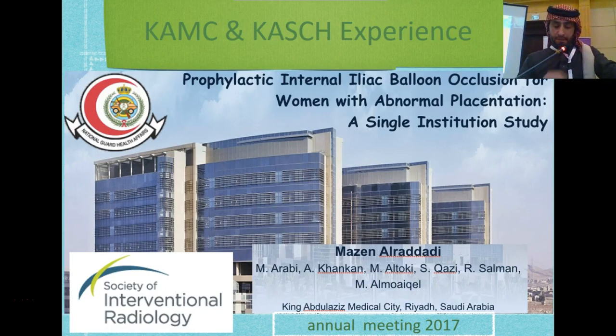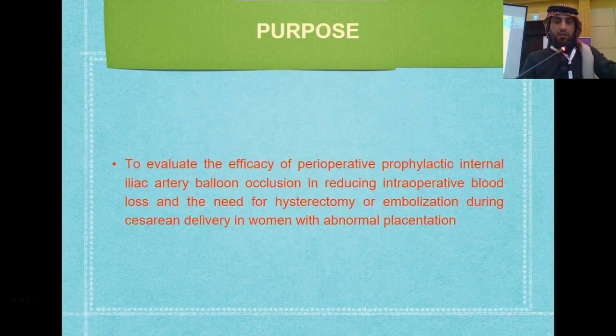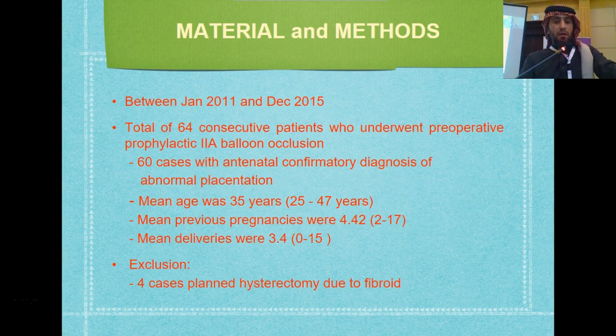So we've done a study. It's a presentation, as a matter of fact, submitted for publication, on using internal iliac artery ballooning. Our purpose was to evaluate the effectiveness of internal iliac artery ballooning. From 2011 to 2015, we collected more than 64 cases.